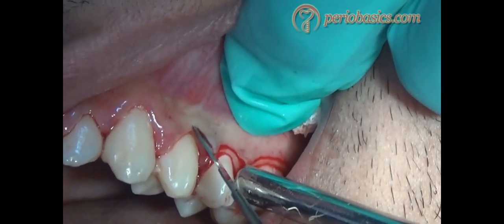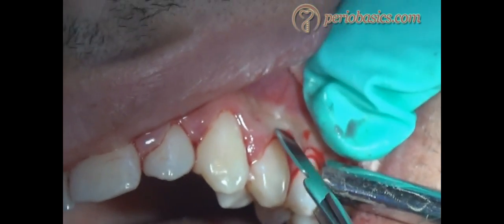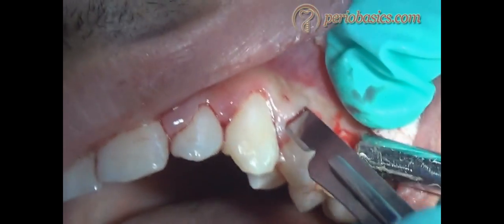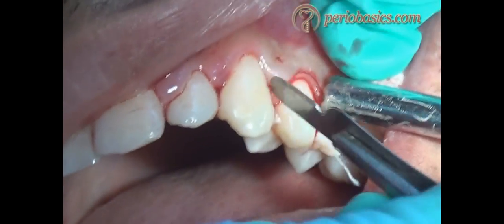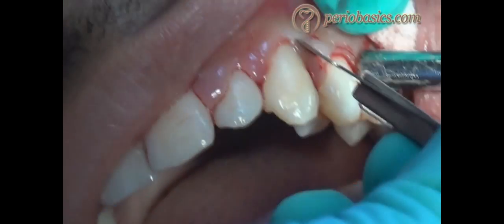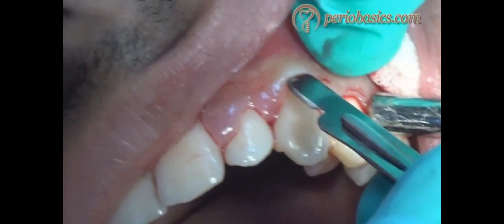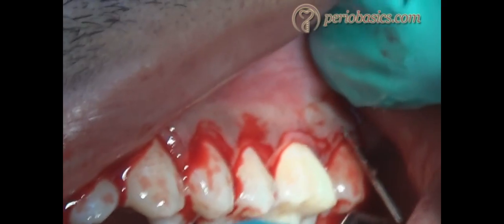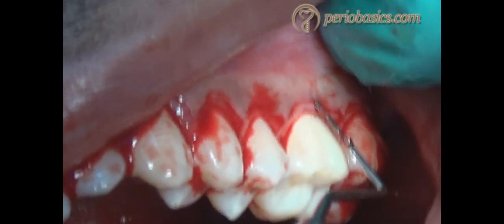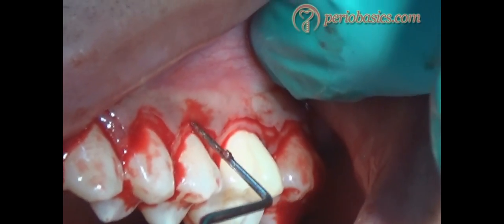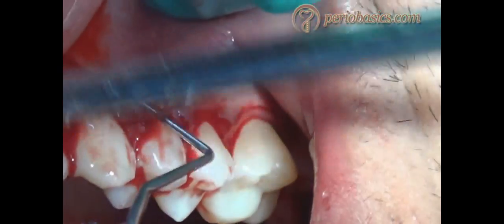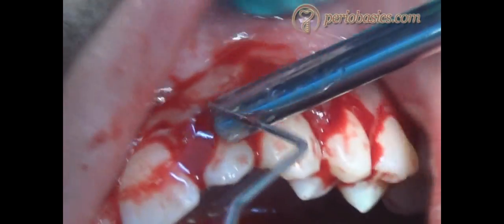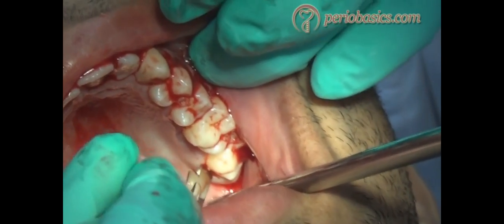You can see the malformed gingival margins, so we have to include these into the incision so that a fine gingival margin can be achieved. The incision line is very clear and we have a triangular wedge of tissue after the incision has been placed.